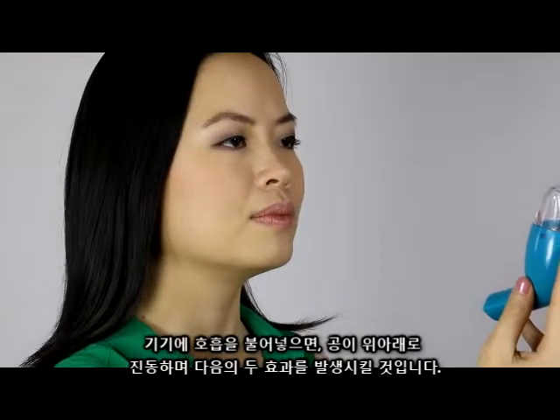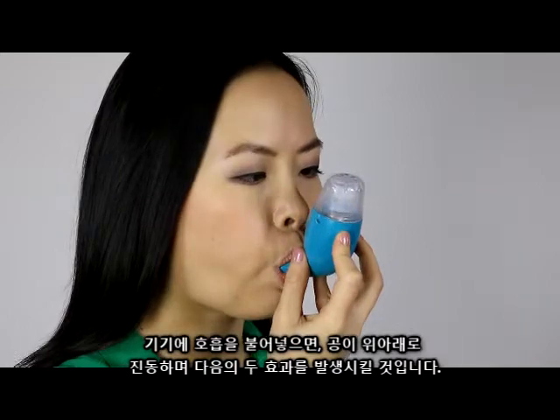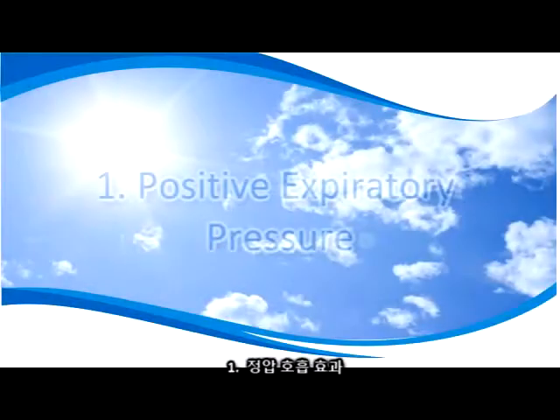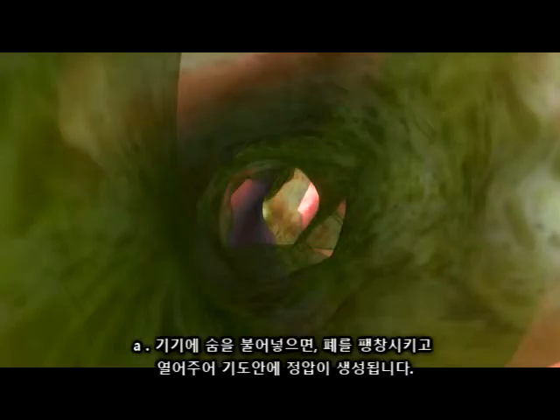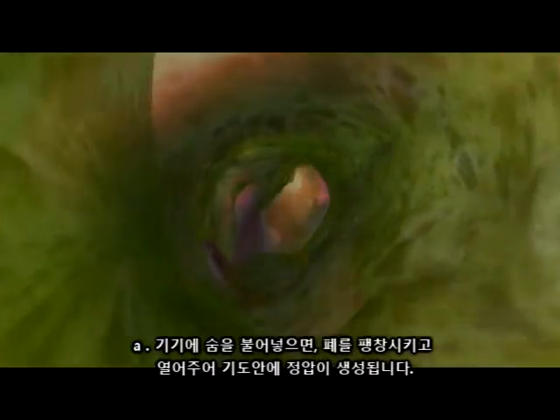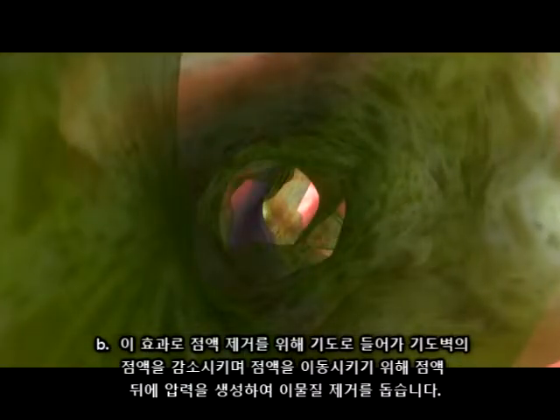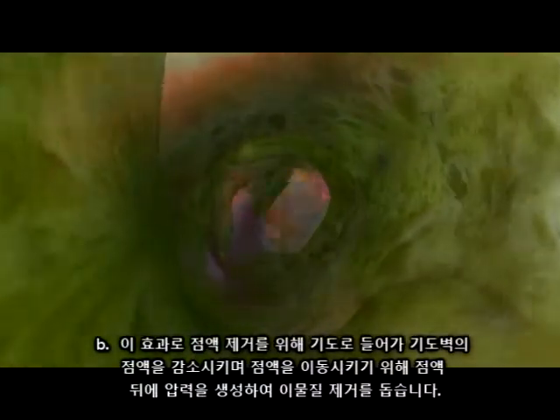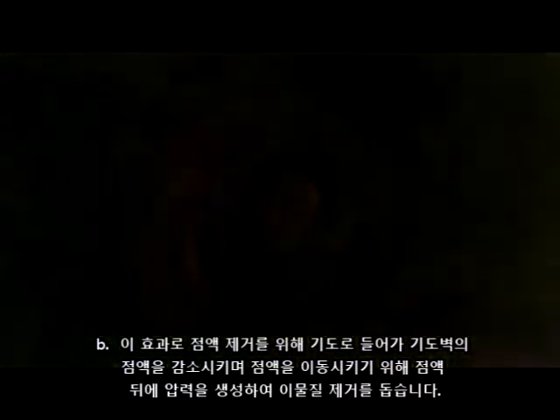When breathing into the device, the ball will vibrate up and down, causing two distinct effects in the airways. 1. Positive expiratory pressure: When you blow into the device, it creates a positive pressure in your airways, inflating them and opening them up. This helps to loosen any blockages, creates pressure behind the mucus to help start the mobilisation stage, and allows loose mucus on the walls to loosen and enter the airways for removal.